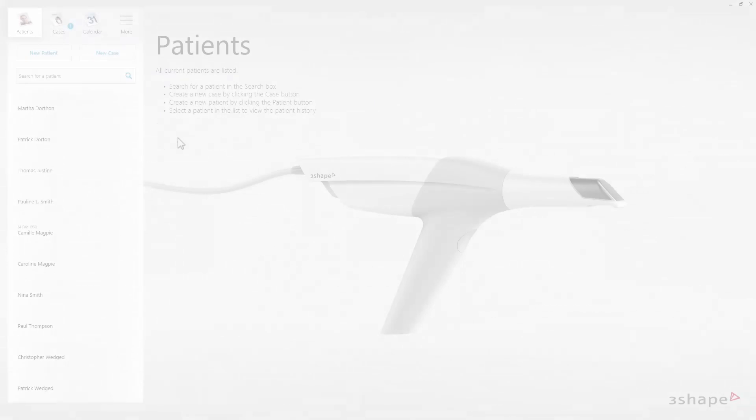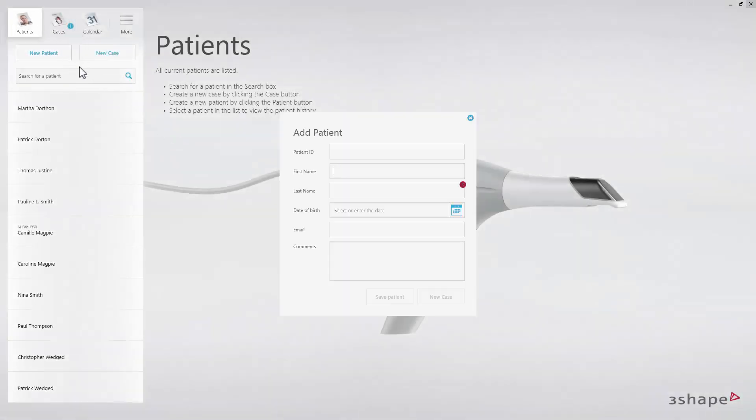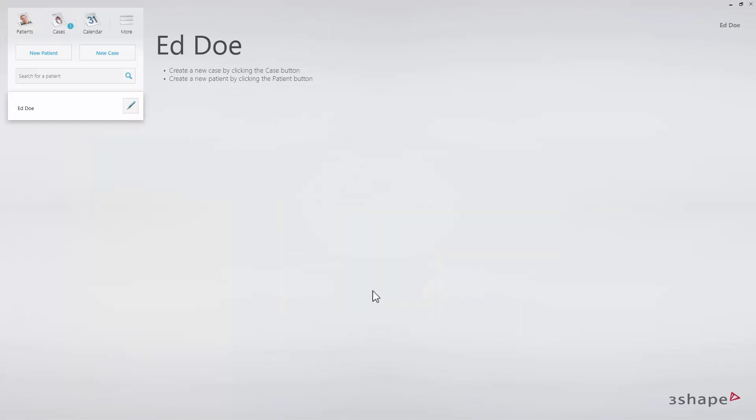Let's first look at how to create cases from the patient overview. To create a new patient, click on new patient. Fill out the required fields. The patient list will appear in the upper left corner.